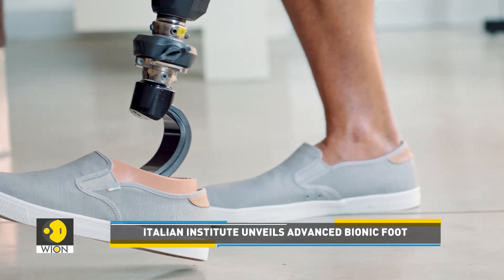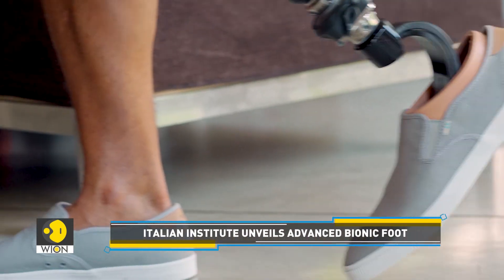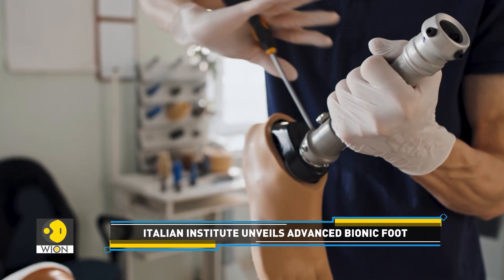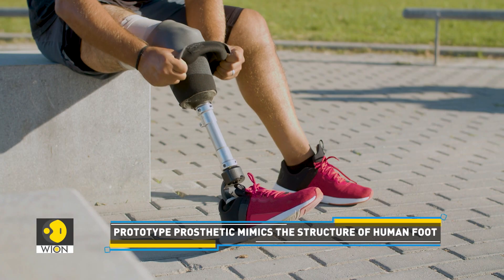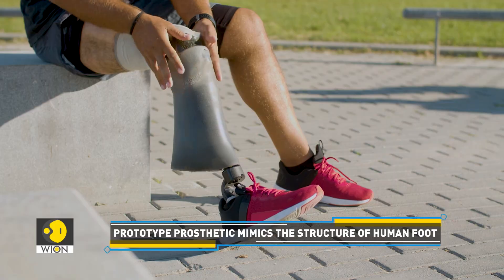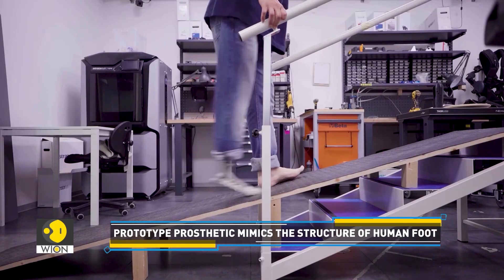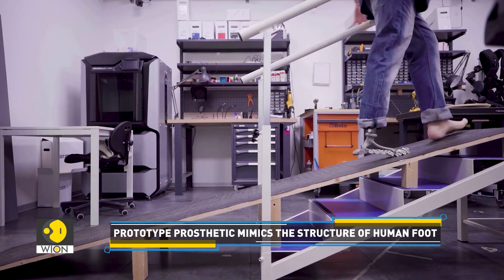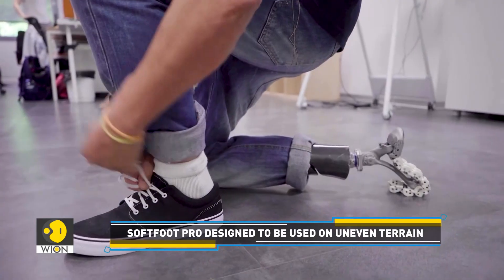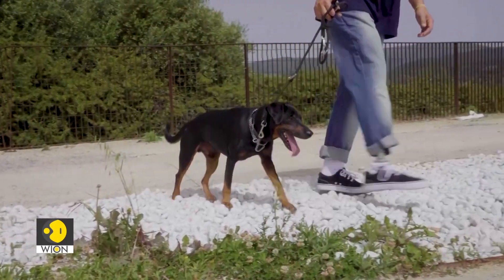Traditional prostheses and humanoid robots generally feature flat or low-compliant feet. While these designs offer stability, they fall short of adapting to various terrain and postures, such as kneeling or bending. However, the Soft Foot Probe's lack of motors or electrical components makes it waterproof and versatile for outdoor use on various terrains, eliminating the need to switch prostheses for specific activities.